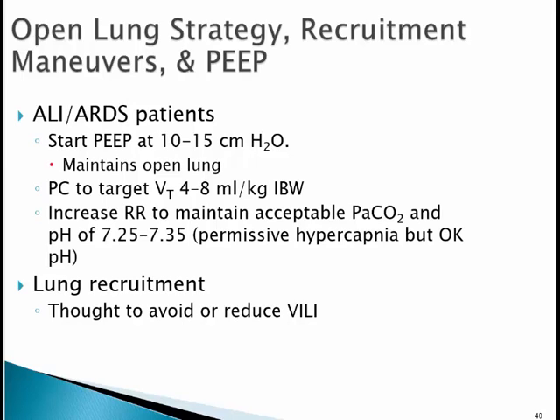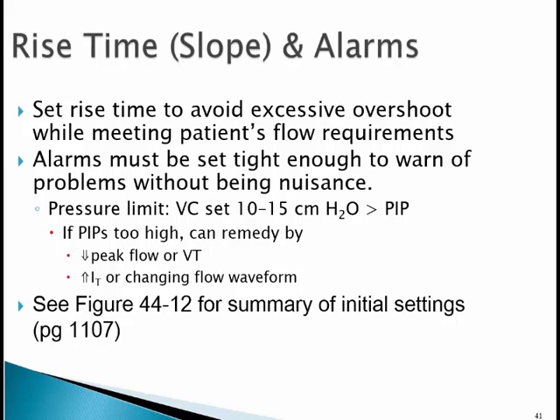And then lung recruitment. This is where we talked about where you increase the PEEP to a significant level of 30 or 40 centimeters of water for a short period of time, like 3 minutes, recruiting the alveoli, and then gradually decreasing the PEEP to maintain the recruitment. If you have the option to set a rise time or slope, this is the time that it takes to reach the peak pressure. In some ventilators, it represents part of the waveform. And so typically it needs to be steeper rather than shallow.